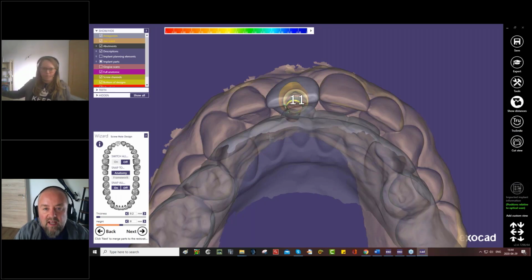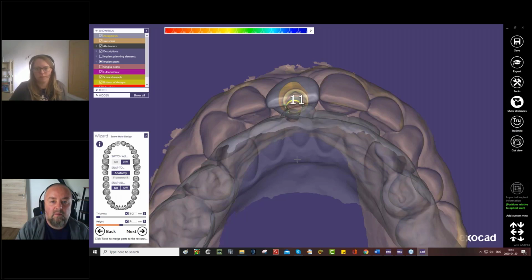There's one question, maybe there's a word I'm not understanding. It's about the marker for the rotation position of the hexagon on the guide, and he's asking, does it keep spatial information? Do you know the word spatial? Yeah, that's Lucas. Maybe he knows better, but I think it's how it's located. I think he's asking if the guide saves in the position that it was designed on the model, or if it's just kind of a generic default position.